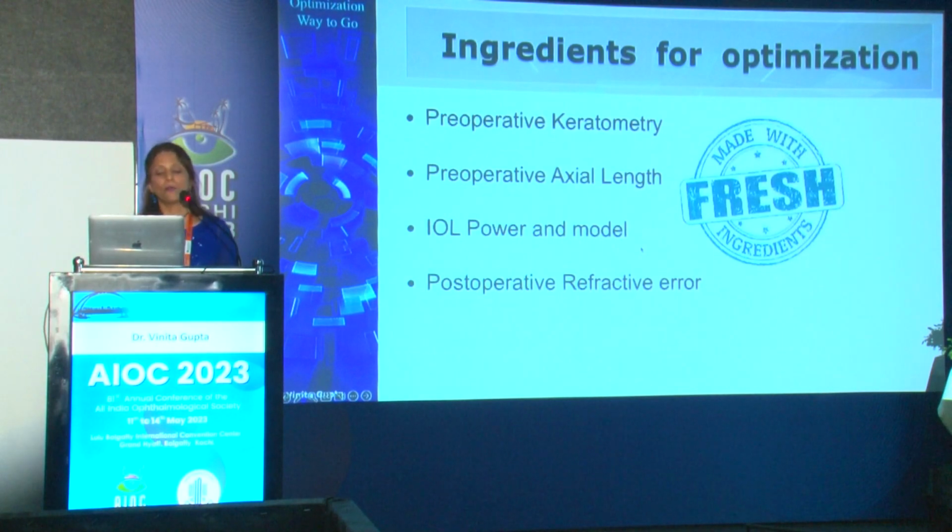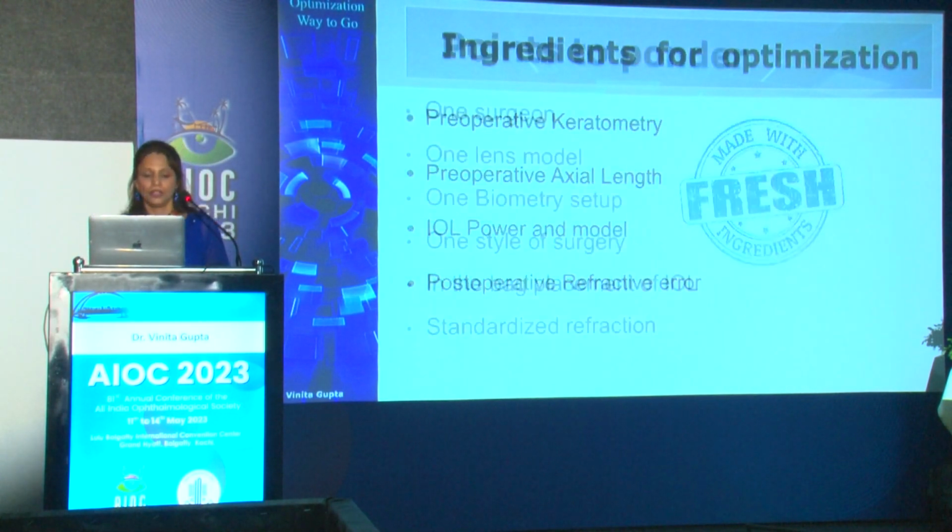The same things: the preoperative keratometry, the preoperative axial length. The next important thing is the IOL power and the model which you are going to use, and the postoperative refractive error which you have from your previous cases.